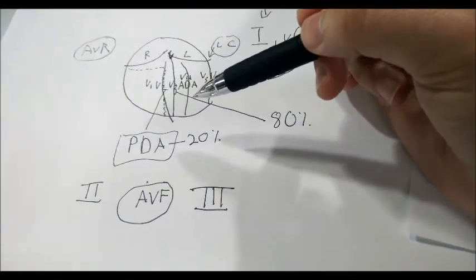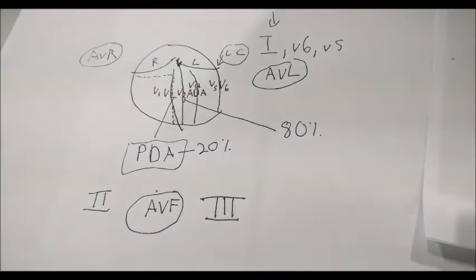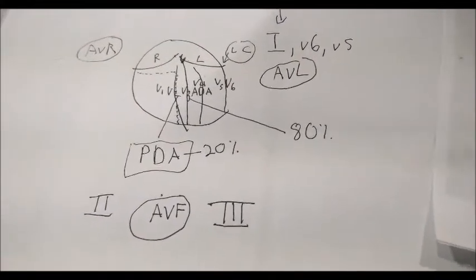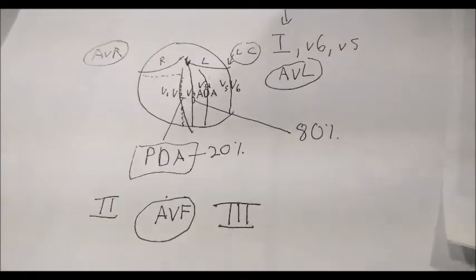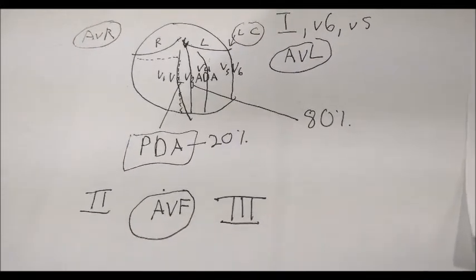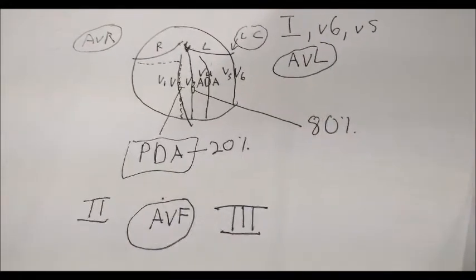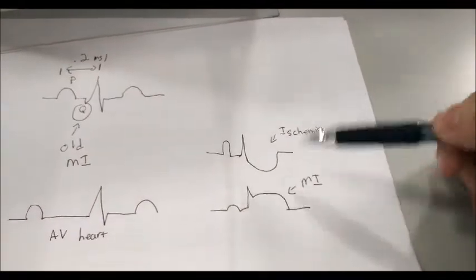If angina is stable, then it is only caused or worsened by exercise. Stable angina is when you have chest pain only when you exercise. Unstable angina means that you have chest pain even when you're at rest. So that is more or less what you want to look at when you're doing EKG. You want to look at the different leads, and at the pathology of the leads, to show you what's going on with the heart.